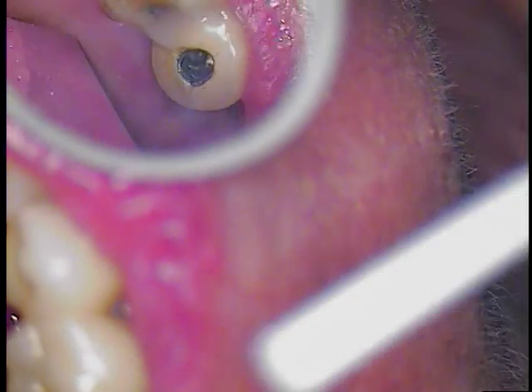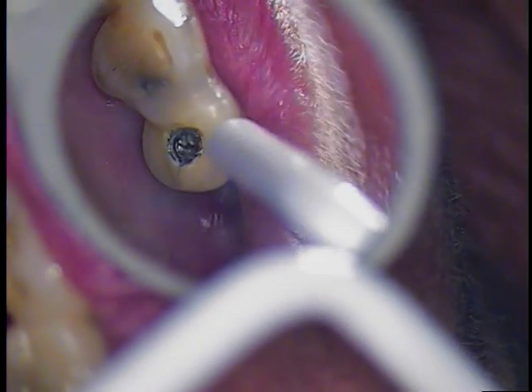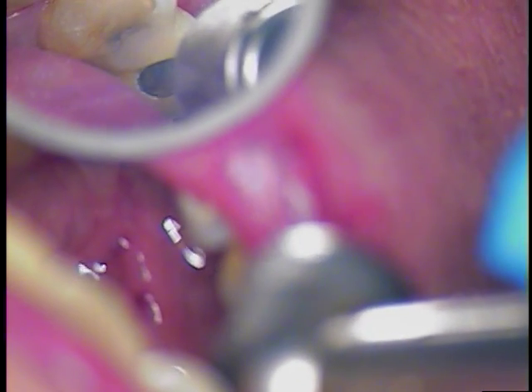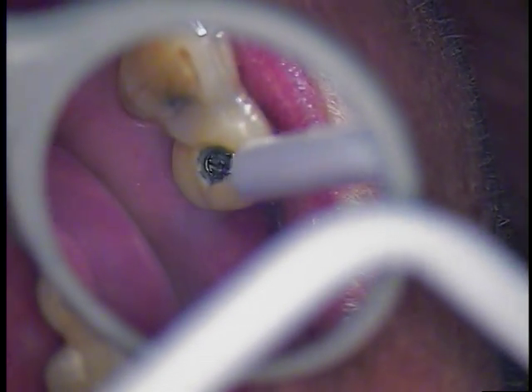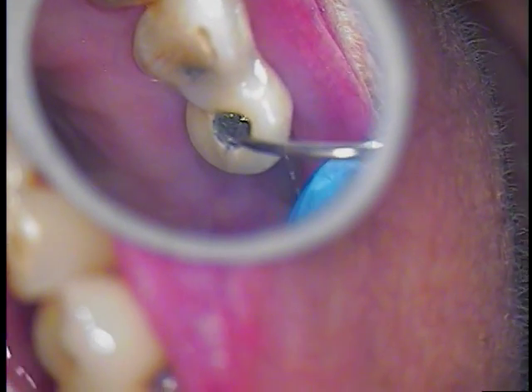Suction only. Suction again. Okay, let's go see what we're looking at. I'm going to take a little break — I'll be right back. I'm going to use an endodontic instrument. Let's go.